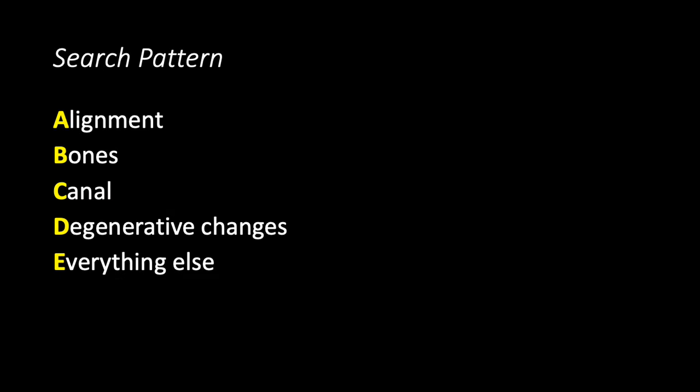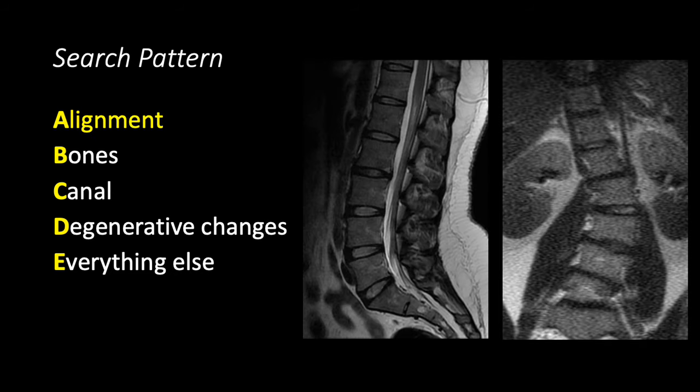If you're interpreting imaging, it's important to have a search pattern to make sure you don't overlook anything. I use the ABCDE approach. A is for alignment and can be assessed in multiple planes. On the sagittal plane, you can assess the degree of lordosis or kyphosis, and you can also evaluate for any listhesis — that is, displacement of one vertebral body anteriorly or posteriorly with respect to another. If you have a coronal sequence, you can assess for scoliosis as well.